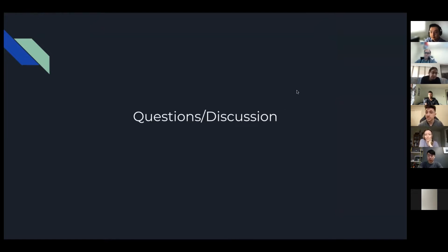Yeah, I can take a shot at answering that, and then whoever wants to jump in. Thank you for your great comments. I think that's a great point. It's akin to the classic teaching of a patient coming in with an elevated JVP, and you give them a whopping dose of Lasix, and you find out later they have severe TR, and that's why. It's a similar concept here. And if you do see a really high VExUS grade score, our question for ourselves is, what is the substrate that's causing that? So looking at the heart, looking at the right ventricular function, looking for TR, all of those things are very important.